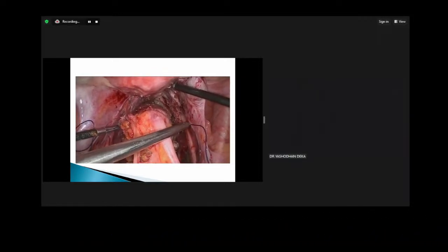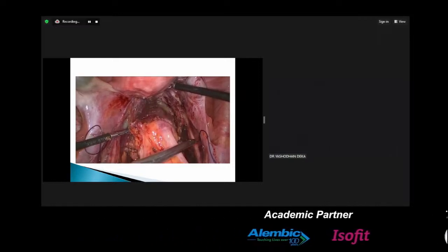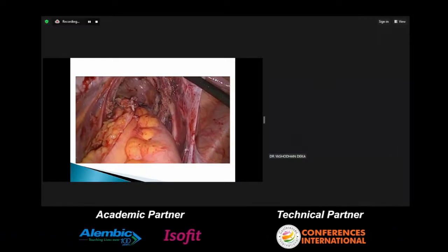Okay, you can see that it's beautifully approximated. Absolutely clean pelvis now. You can actually see the hypogastric nerves on both the sides. A good ureterolysis done. And this is the end of the surgery.